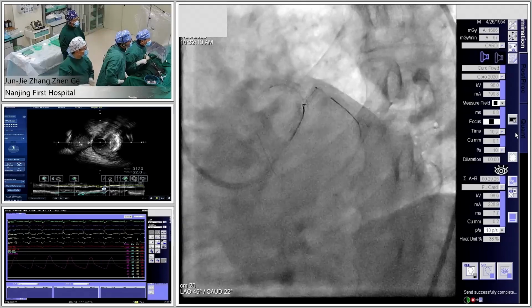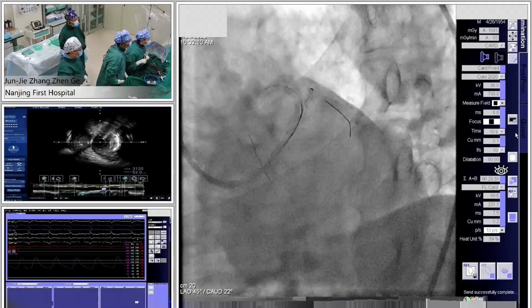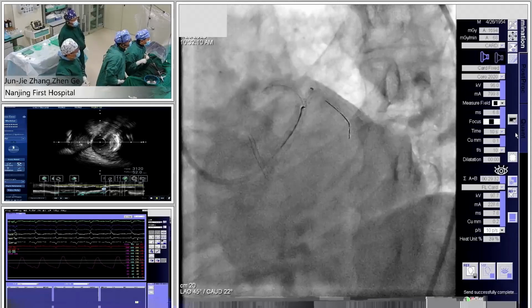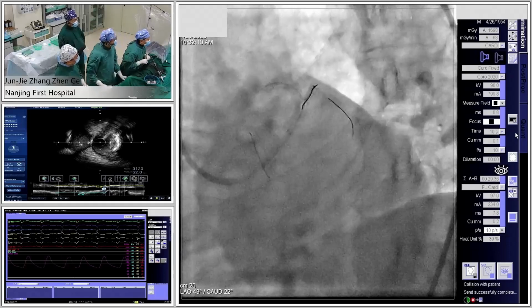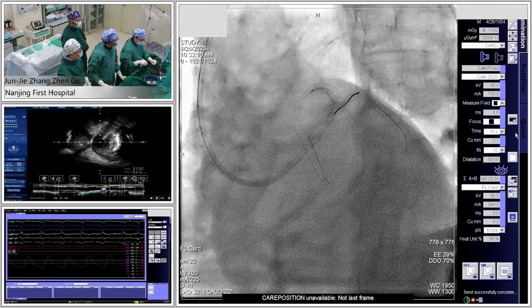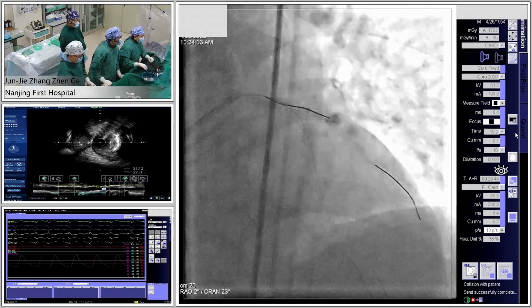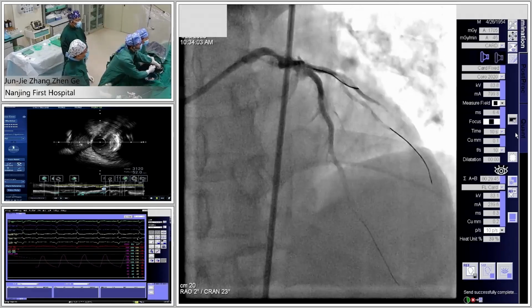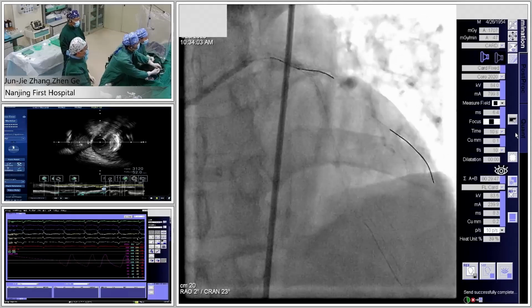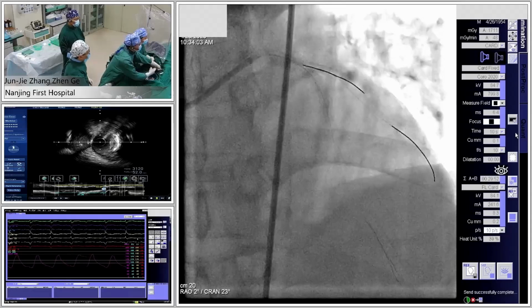So I think if there is some difficulty for the side branch rewiring after balloon crush, at these times, okay, you see successfully. Another option is to use IVUS recheck. If we have successfully achieved a full crush, it's very important. If we did not get a full crush, sometimes we will have resistance or difficulty for the side branch rewiring. I think the up strut is also okay.